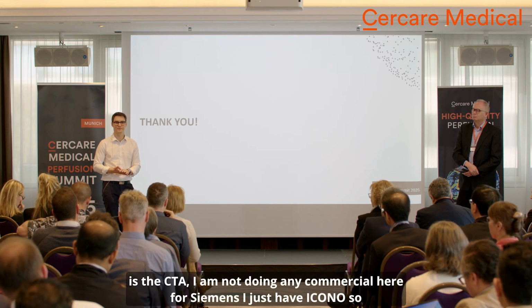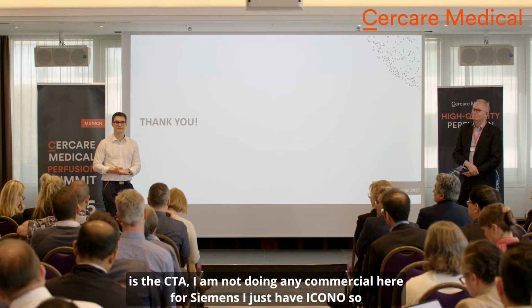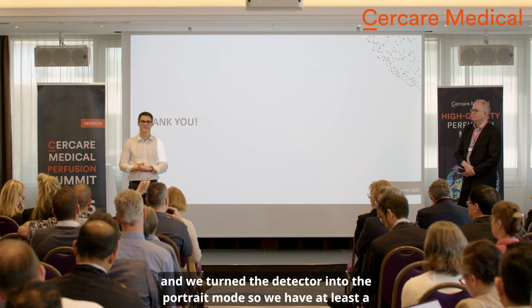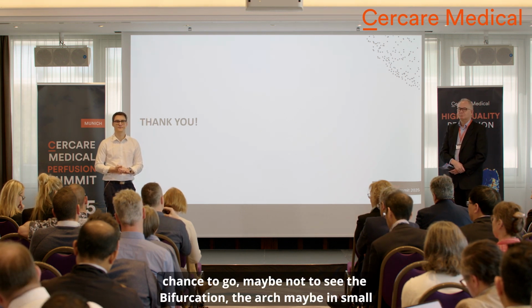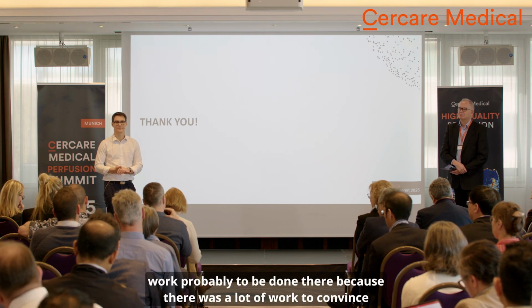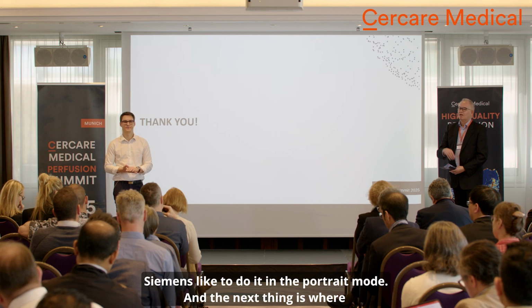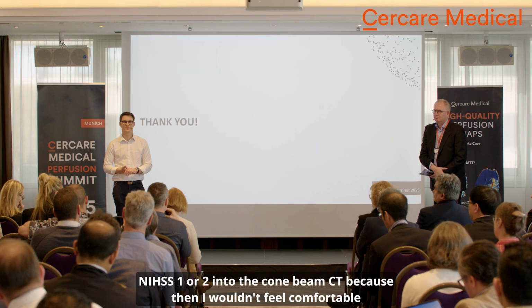Then the next thing is the CTA. I'm not doing any commercial here for Siemens. I just have Artis icono, so that's why I can talk about it. We do a CTA on the table, not only CBCT, and we turn the detector into portrait mode, so we have at least a chance to see, maybe not the bifurcation or the arch, maybe in small people. I don't know how it is done with Philips, to be honest, so there's also work probably to be done there, because there was a lot of work to convince Siemens to do it in portrait mode. And the next thing is, where do you make the cut? Do you want to transfer all of the patients, even with NIHSS 1 or 2, into the cone beam CT?